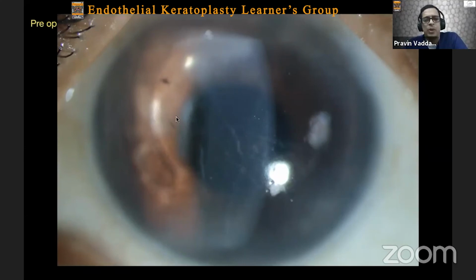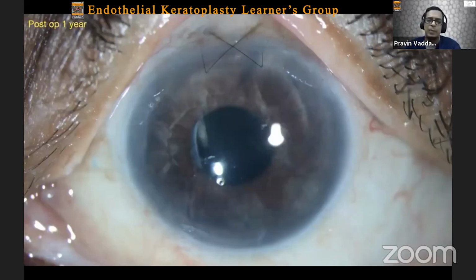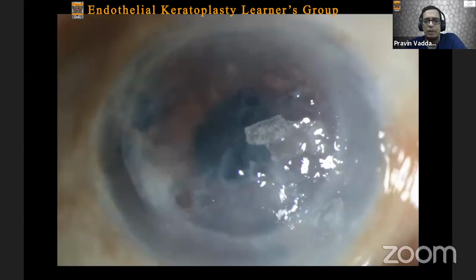Sometimes you also will see patients who have had an ACIOL that has been implanted several years ago and doesn't seem to impact vision very much. But those patients who've had a recent surgery and have an ACIOL in the eye, it probably is a good idea to exchange the lens and replace it with a lens that is either behind the iris or in the sulcus, or a lens that is sutured to the sclera. As you can see here, this is a lens fixated with the Yamane technique, and this patient is doing really well about a year after surgery.